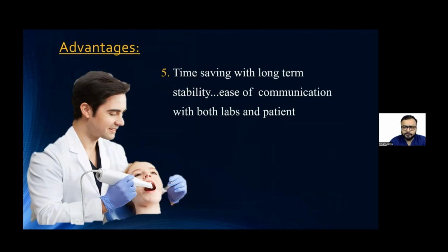As I said to you, it's very, very easy just to share your data with your lab. Just by using Medit link, you can share the link, you can share it via WhatsApp, or you can use an email and send the link. If you're a person who would like to export the data and then send it in an email, you can do that as well, but it's pretty quick. You don't have to wait for somebody to come and pick up the material, the impressions, and you don't have the risk of the material getting distorted. That's a big plus for an intraoral scanner.